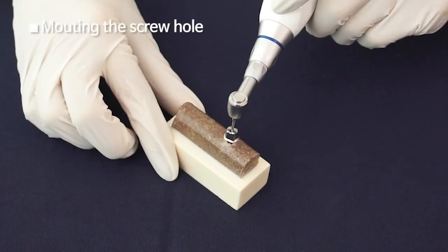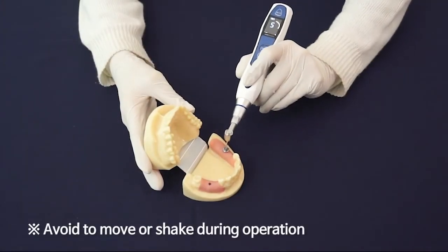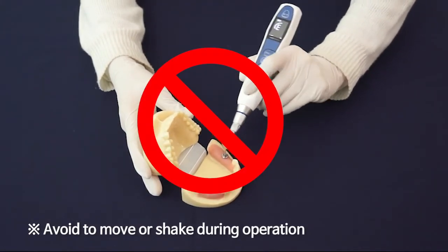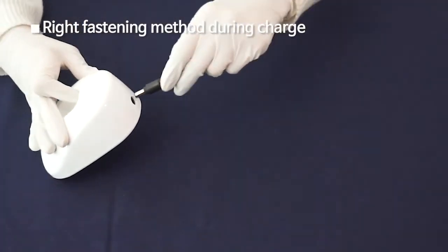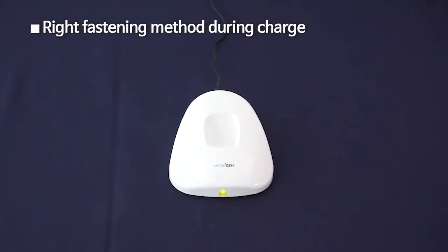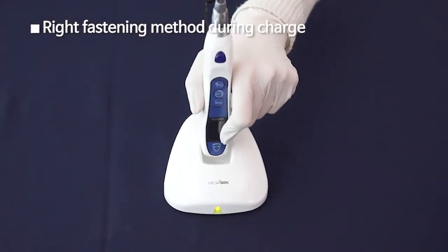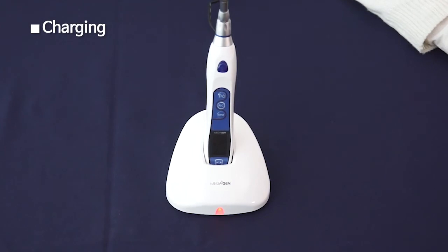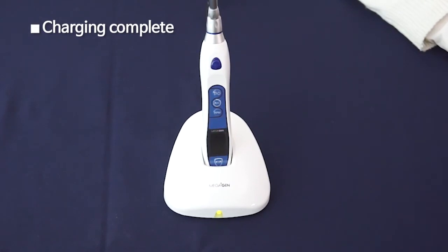Rotating the motor handpiece body like a manual ratchet will damage gears in the contra angle part. Mount the motor handpiece correctly onto the cradle. The LED light changes from red to green when charging is complete. The Meg Torque operates perfectly in full charging condition.